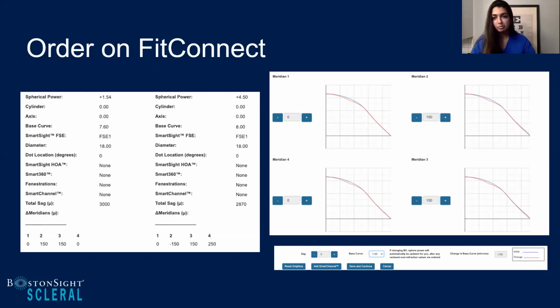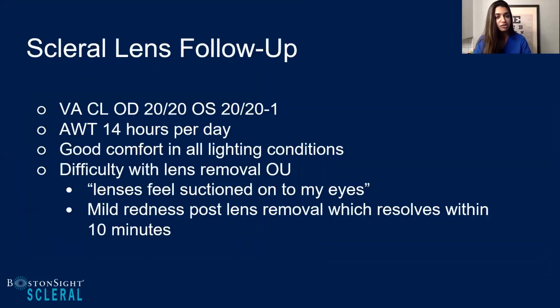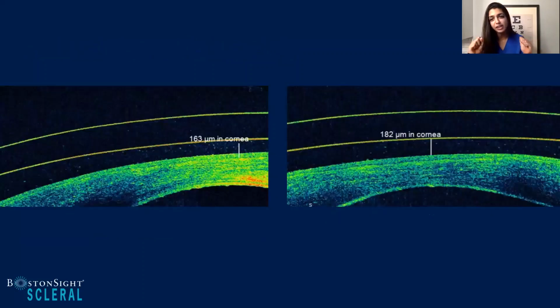So she picked up her lenses, she went through IR training, and eventually I saw her back when she had well adapted to the lenses. She was wearing them 14 hours a day. She was all excited. Dr. Dave, I love these lenses. They're comfortable. What a difference. But the one complaint she had was at the end of the day, she felt like she was fighting to take the lenses off. Lenses felt suctioned onto the eye. And when she did finally remove them, her eyes would be a little red for a few minutes.